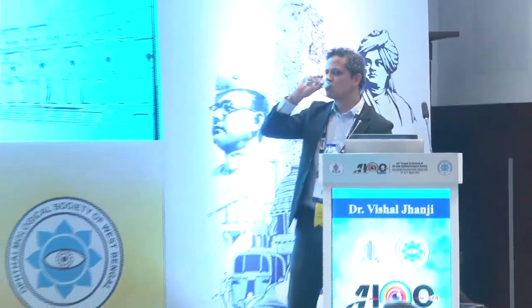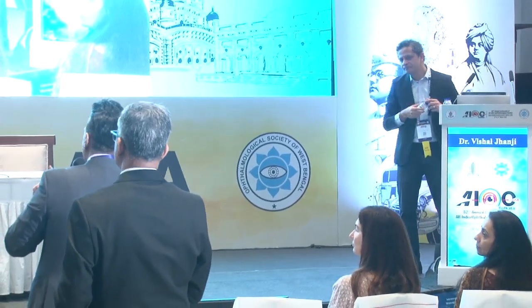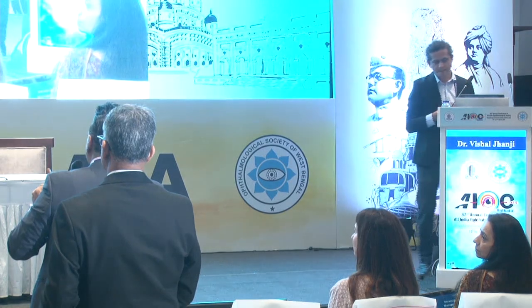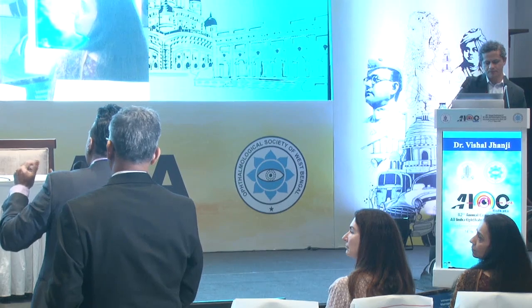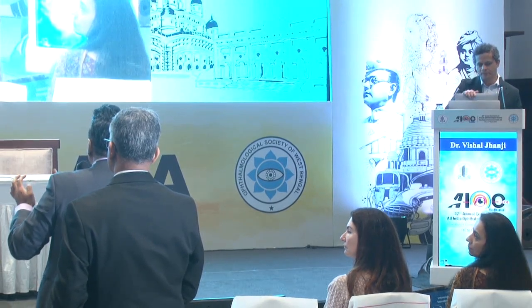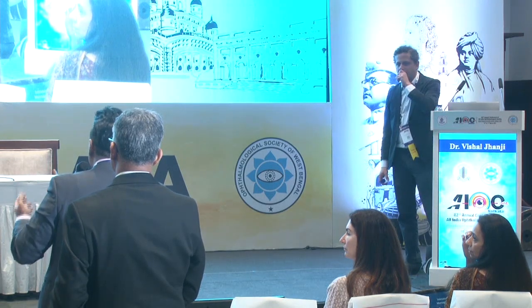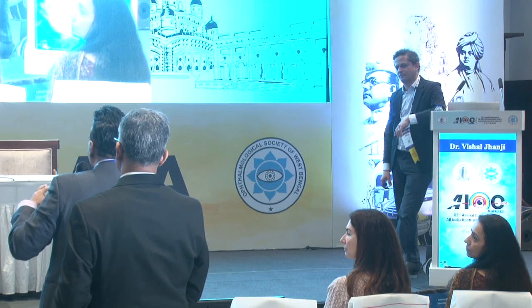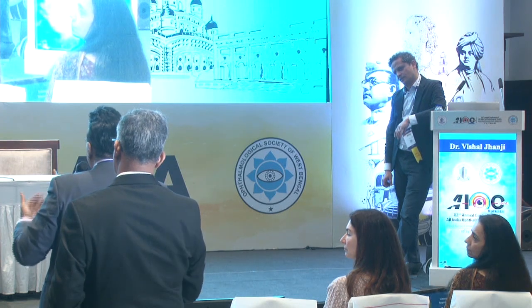So what we're doing now, and we're just finishing off a paper on this, is that we're looking, to answer Tony's question, because I see a lot of patients who may have slight abnormality on posterior photo, like Sanjay showed. Actually, some have no abnormality, but they have this fibrotic scar on Descemet. So we're now using densitometry, because I realized from that paper that the problem is that we need a very good photographer. When I asked, lots of people started sending me images saying, John, can you quantify it? But the quality was so poor. I was like, okay, this is not going to be practical. So then we thought, is there another way we can look at this?